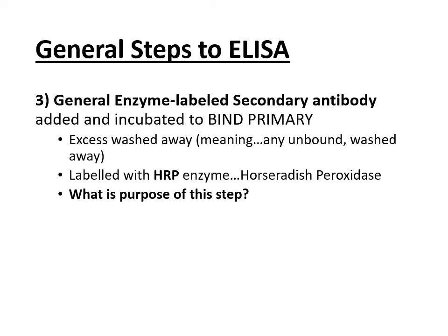So when you add this secondary antibody, if there is currently any well that has a primary antibody complex in it that's stuck because the patient was infected, the secondary antibody will bind to those primary antibodies. Now, the other aspect of the secondary antibody that's important to remember, not only will it bind to primary antibodies, but it's also specially built to have a form of detection attached to it.